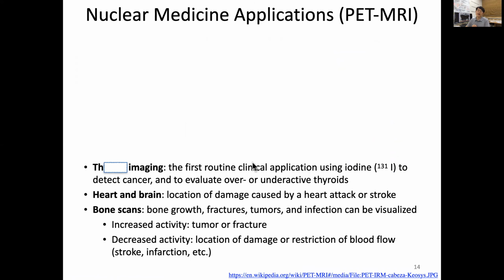So now I give you another example. The problem of PET is it has an extremely high sensitivity and specificity, while it does provide a little poorer anatomical structure. So that's why PET can be combined with another more structural image such as CT or MR, and that gives us a better view of what's going on in the body.